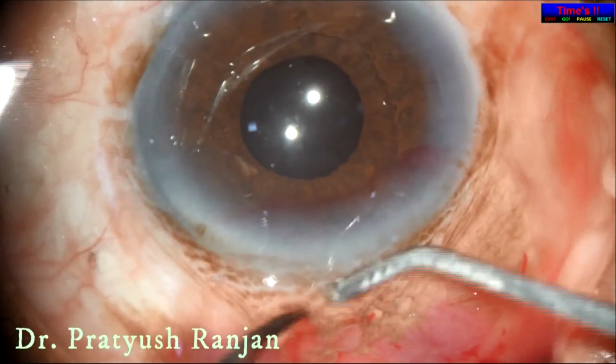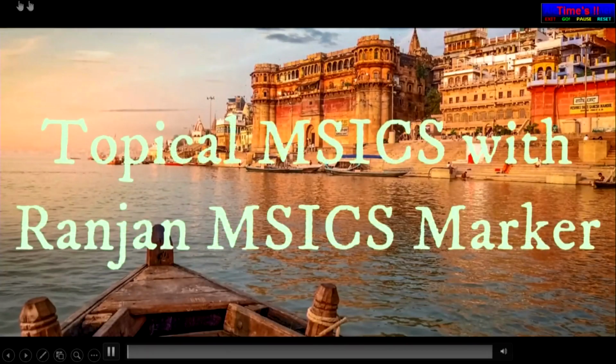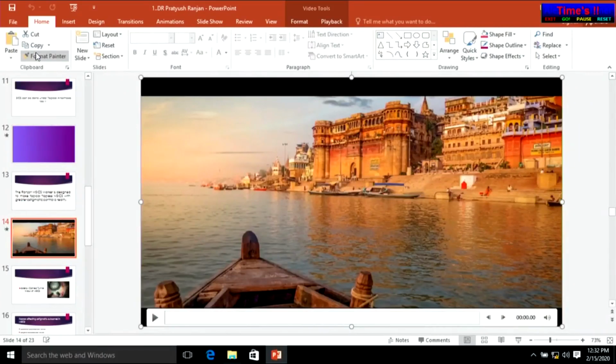Initially on the microscope it would look bad, that there's a hemorrhage there, there's a clot there. Once you clean that up, everything is so good. And in fact the fibrin which has been produced, as he said, will close everything so well. The conjunctiva will sit back, the sclera will sit back, and doing SICS without cautery is wonderful. Thank you, sir. Thank you. Any more questions?